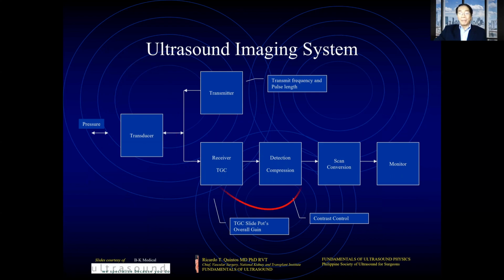And then we talked about how the beam is computed, by using certain assumptions on the acoustic velocities and the depth, and how to adjust the images so that you will get better resolution and better signals, and how to use your probe so that the processing unit will be able to have a better processing of the data that came in.